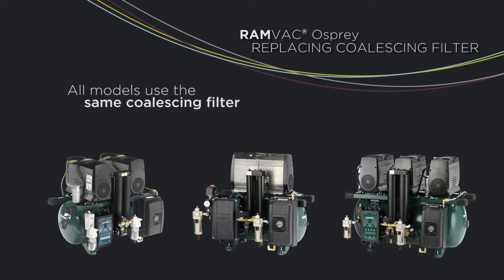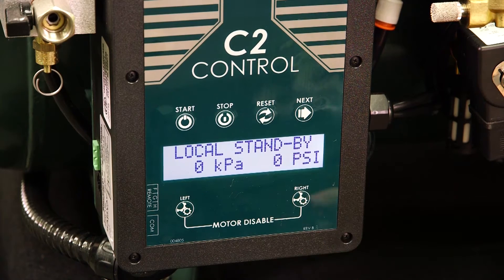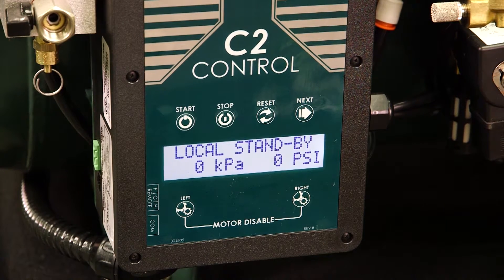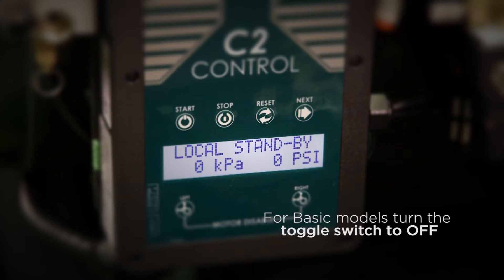Please note, all models use the same coalescing filter. To replace, start by turning the compressor off. For smart models, use the stop button on the C2 control. For basic models, use the toggle switch to power down.